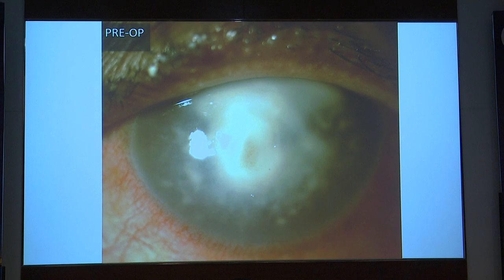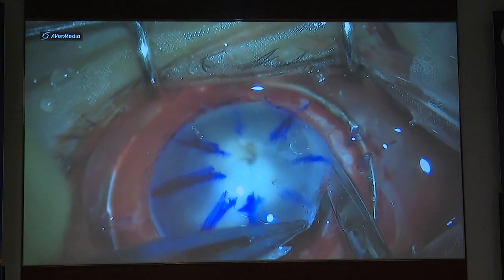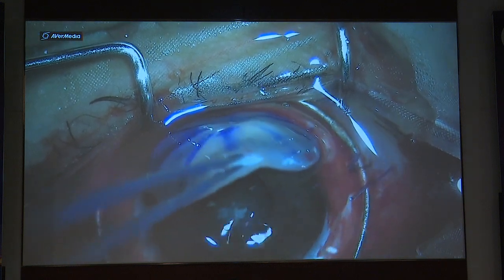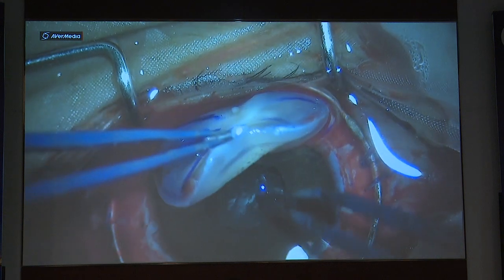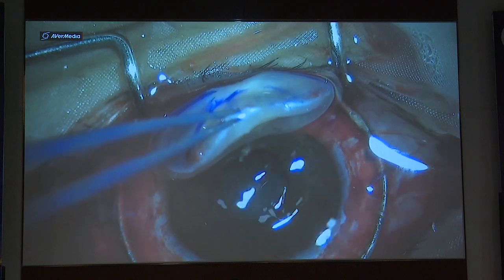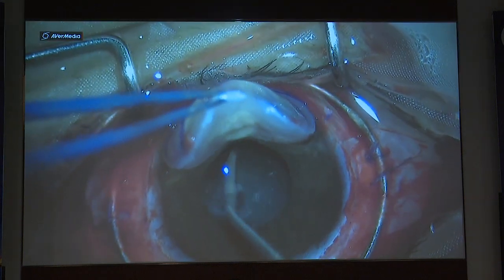This is another case of a long-standing corneal abscess treated for over 2 months outside. There are multifocal infiltrates reaching almost up to the limbus. So here again, I thought of doing a large diameter therapeutic graft. Removed half of the cornea and kept a hinge to see how the anterior chamber looks. And the lens had quite a lot of exudates over the anterior capsule. Tried to remove this. If not, then ECCE would have been done.